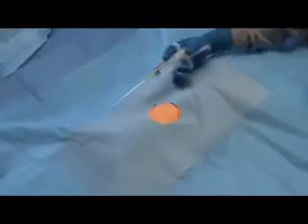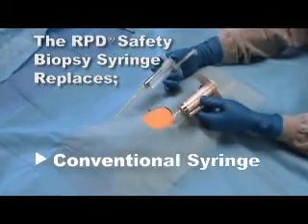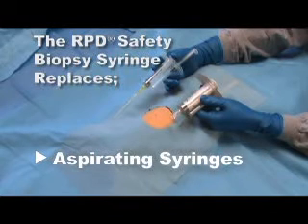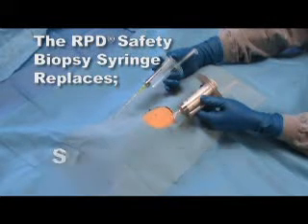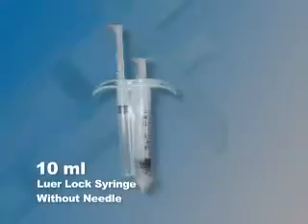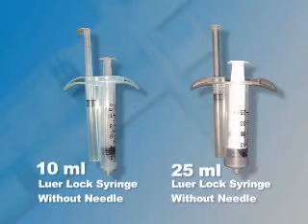In all suction biopsy procedures, the RPD safety biopsy syringe replaces the conventional syringe, aspirating syringes, biopsy syringes, syringe handles and guns, and syringe pistols. The 10ml and 25ml RPD are most commonly used for suction biopsy.